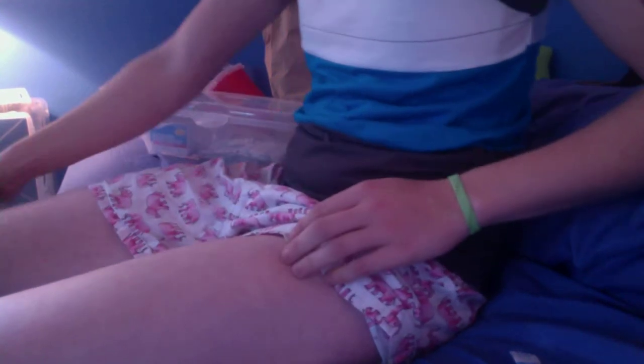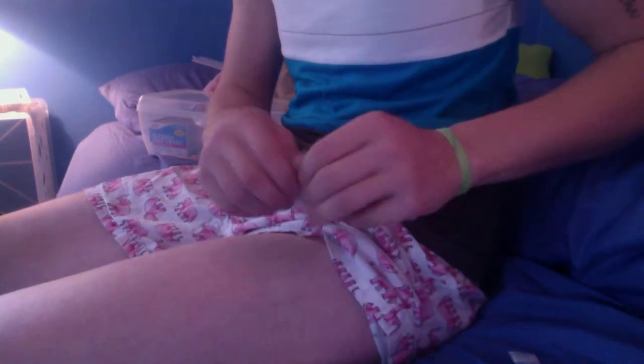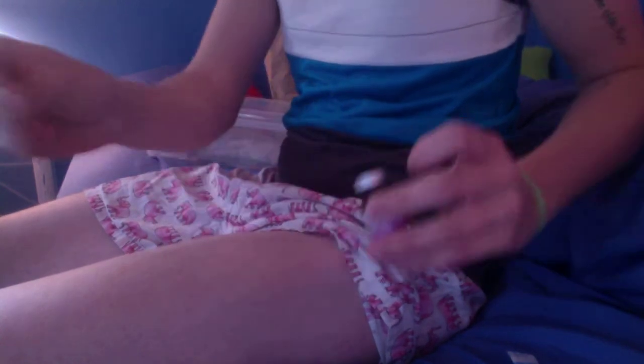Let me take my pants off here. How I do this is — you want to be in the upper third of your thigh, right here, and you want to be on the outer portion where there's a lot of muscle. Then clean it off. You go from the outside in — inside out. And then you use the other side to clean off your testosterone bottle. You don't want to blow it dry because you'll get your mouth germs on it.